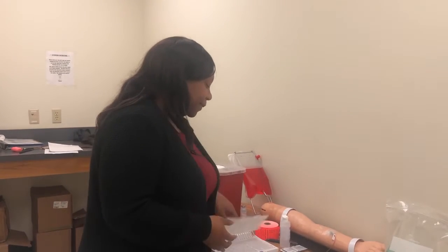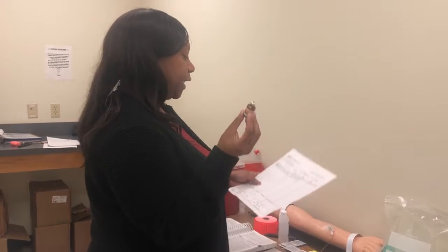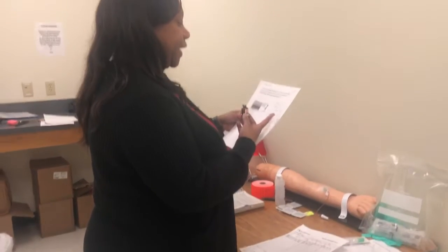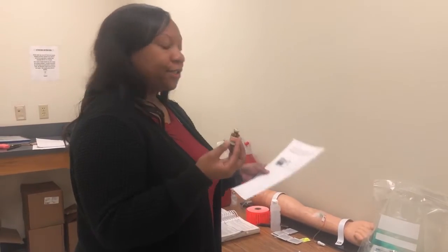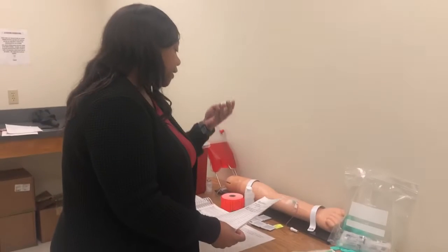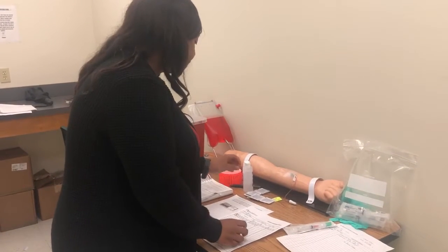At this time, I have my medication, and it comes in about 40 milligrams per 4 milliliters. So I'm giving 30 milligrams. I did do my math, and it's going to be 3 milliliters, given at the rate of 1 to 2 minutes. Also, the expiration is 1 May 2020, so it is not expired.